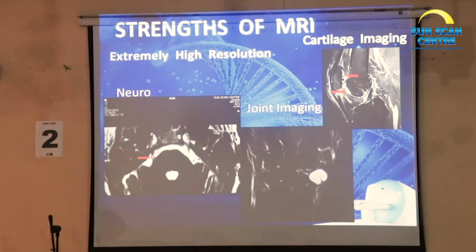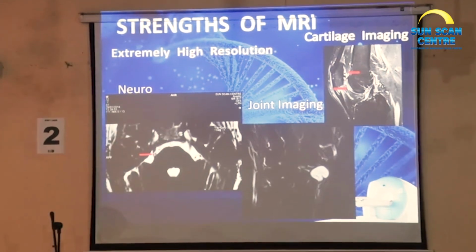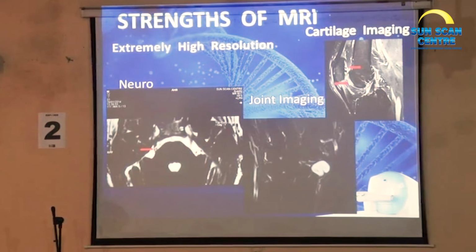Okay, so now that is the image at the level of our ears. Yeah? And there is a red arrow there? Yes. So that red arrow is pointing to a condition called trigeminal neuralgia, where somebody who has it will have extreme pain along the jaw and even on the inside along the teeth. So these people often keep on visiting dentists, and they don't know what's happening, and neither does the treating dentist know, because it is a neurological condition. And this image is 0.5 millimeter thickness.